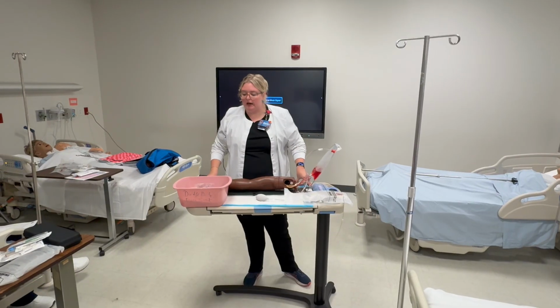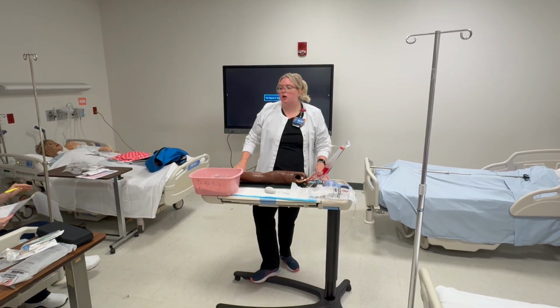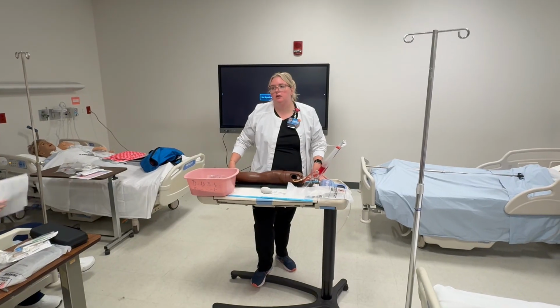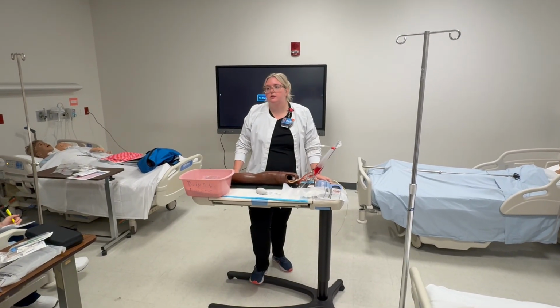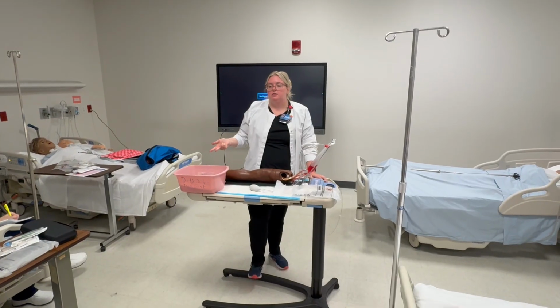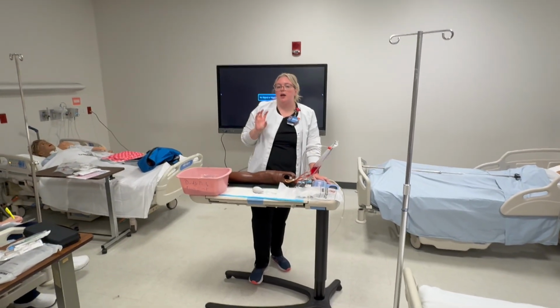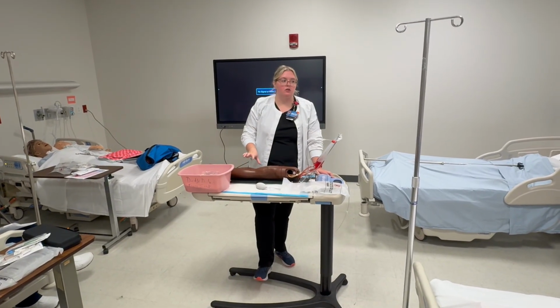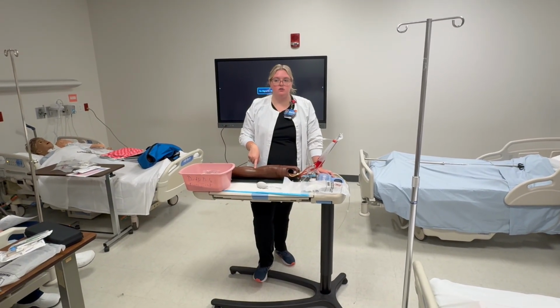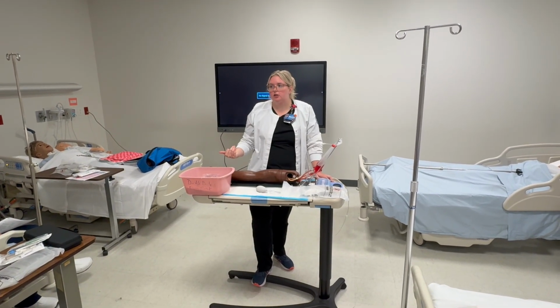Once you select them, you do your first check in the med room of the medications. What are our 6 rights of med administration? Right patient, right drug, right dose, right route, right time, right reason. Correct. You will do that individually for your 2 medications that you are administering. The 2 medications are normal saline and then whatever secondary fluid you're ordered.